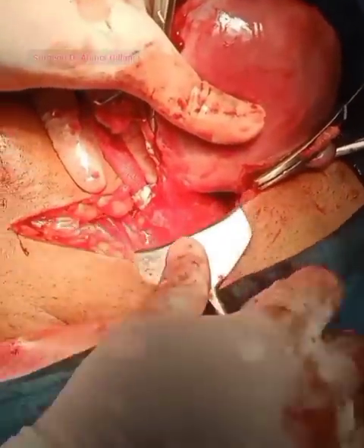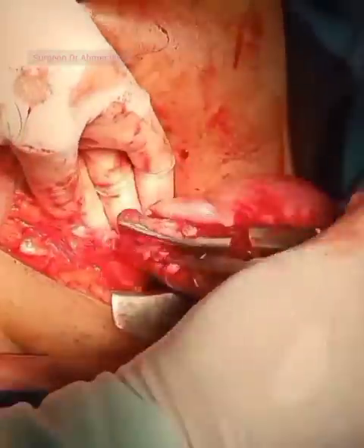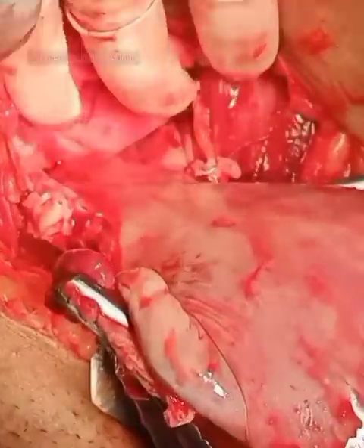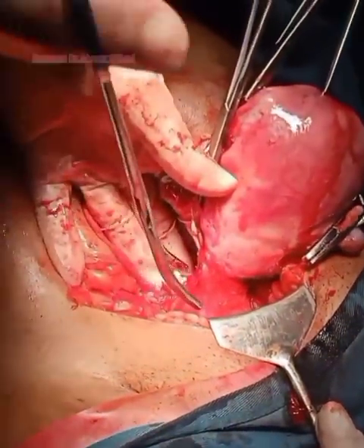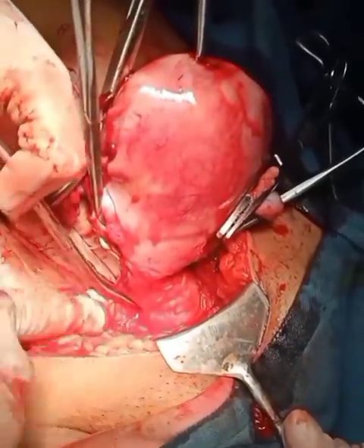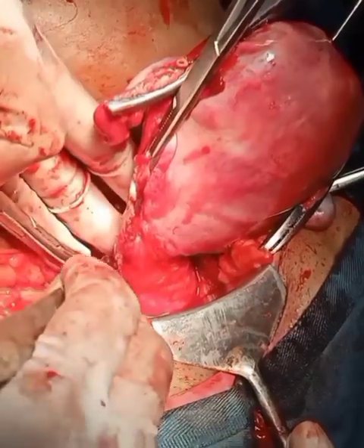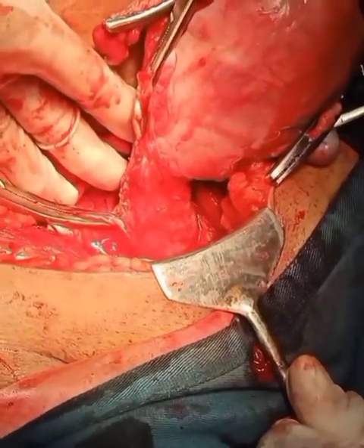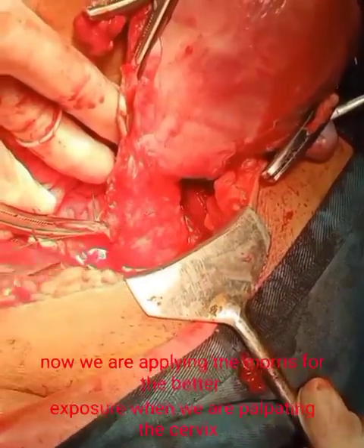We are applying a Morris retractor for better exposure, palpating the cervix and lower edge of the uterus, and then cutting at the cervix. In the video you will clearly see the circumferential area of the cervix that we need to remove. We are securing the bleeding throughout.